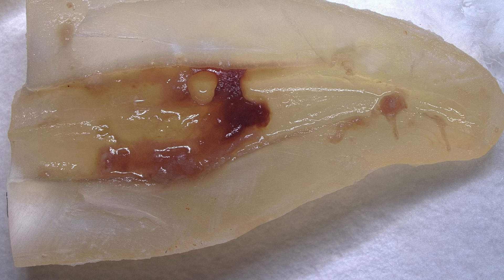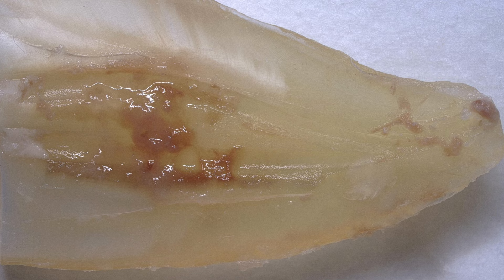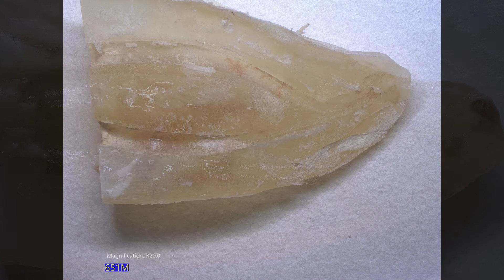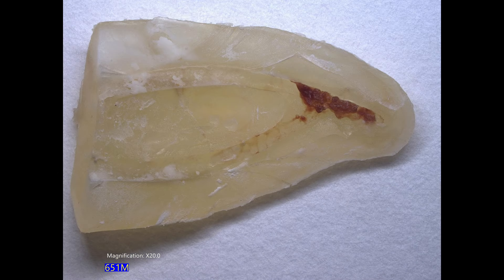Pretty nice anatomy. This is the mesial root sectioned sagittally. So you can see there's quite a bit of pulp tissue still in the root. And this is what the mesial root looked like when it was completely dehydrated.